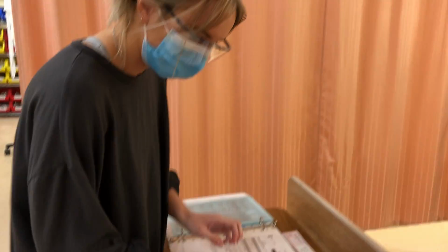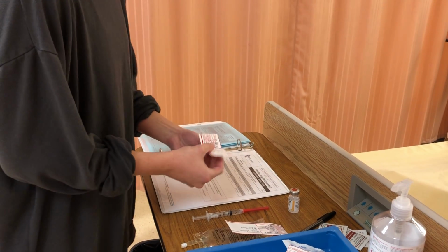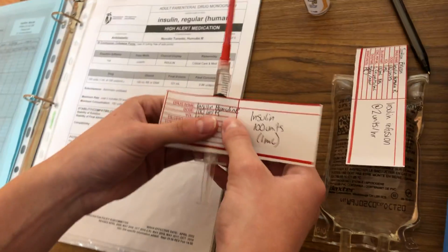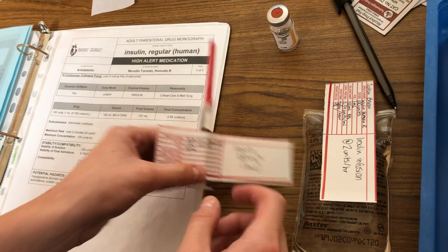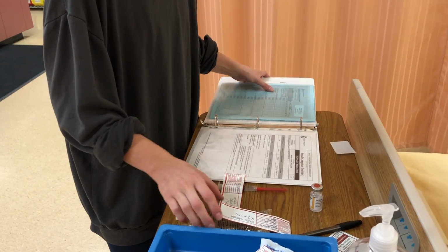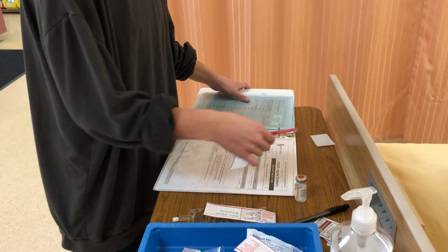So now that I've drawn up my medication, I'm going to put a label on it right away. This label for this syringe has insulin Humulin R. We have 100 units is 1 ml. So we have 100 units in here, and that's 1 ml. So I've drawn up my med.